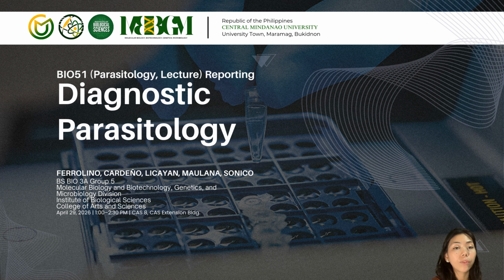Baseline diagnostics refers to the basic and routine laboratory methods that are actually being utilized as a first step in identifying diseases, especially parasitic infections. So these techniques help us directly detect the parasite, its developmental stages, or its products in different clinical samples.